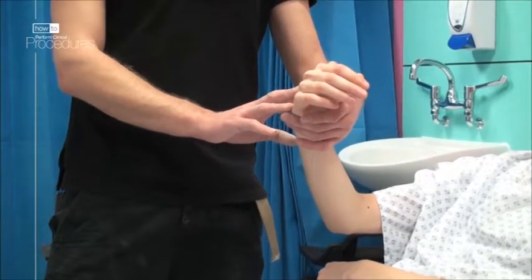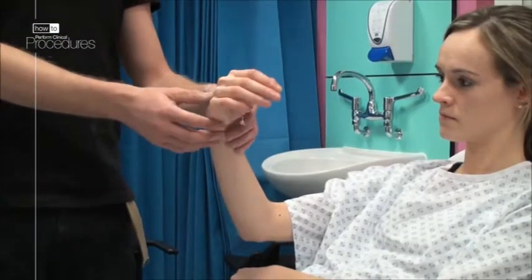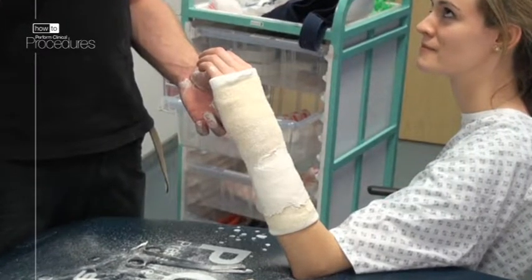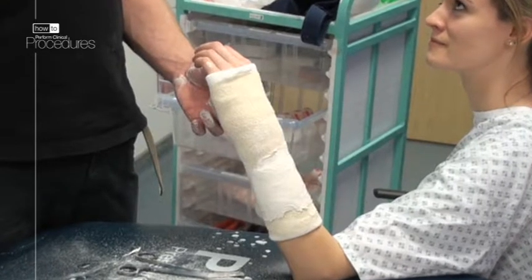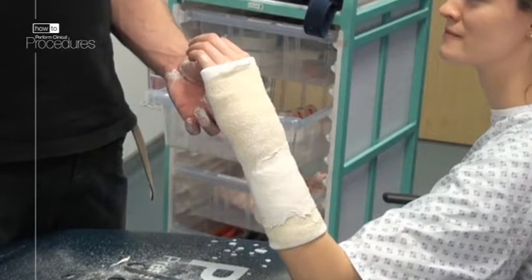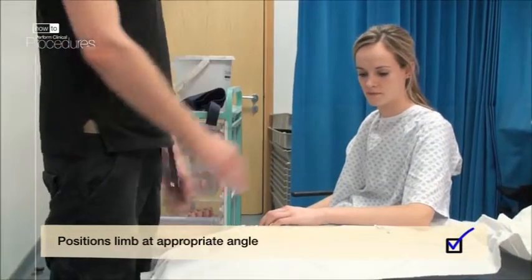A back slab plaster of Paris is ideal to apply as a temporary cast until definitive decisions regarding management of the injury have been made. It's relatively light, strong yet moldable, and allows for swelling in the acute phase. For this arm we shall use 6 to 8 layers; however, if your patient has a large muscle bulk then 8 to 10 layers may be needed to achieve stability.